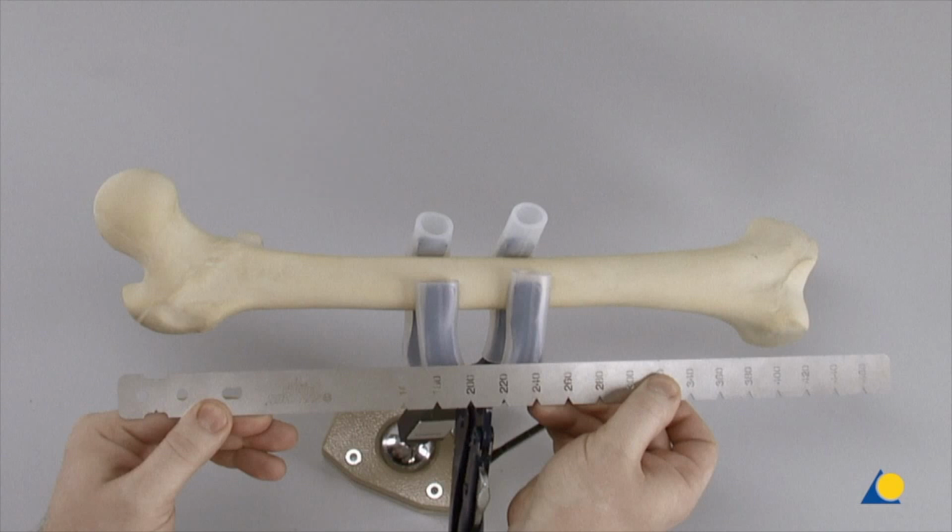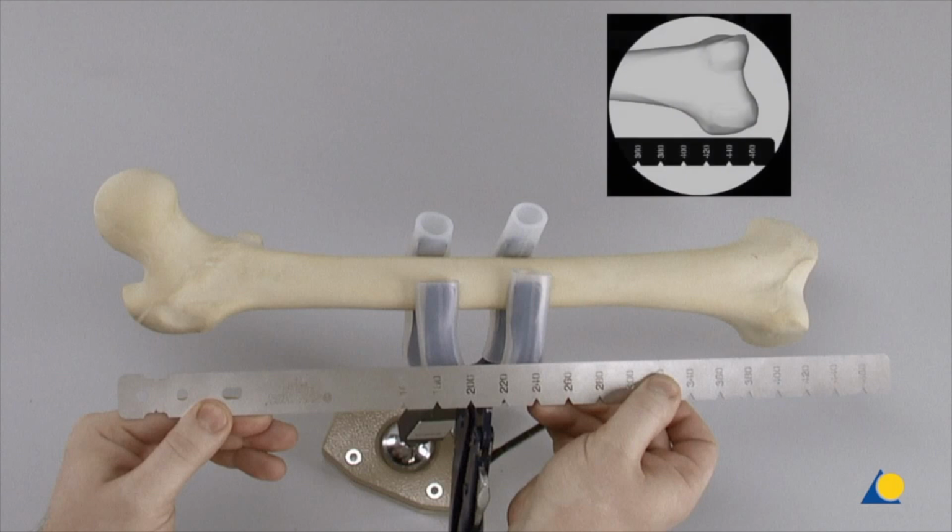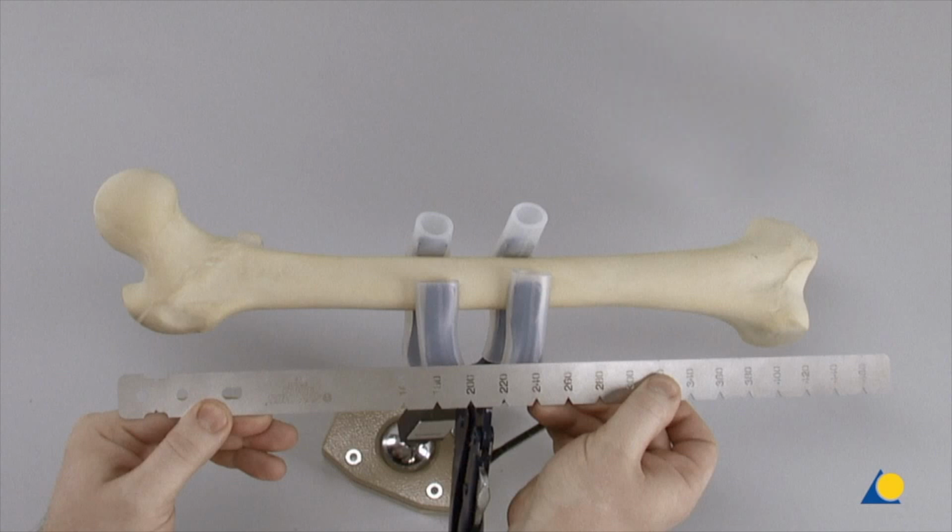The image intensifier is repositioned toward the distal femur, the proximal end of the ruler is aligned with the skin marking, and an AP image of the distal femur is taken. The fracture reduction is verified, and the required nail length is read directly from the ruler as it appears on the radiographic image. As an alternative, the nail length can be determined by using the previously described steps on the uninjured leg prior to draping.